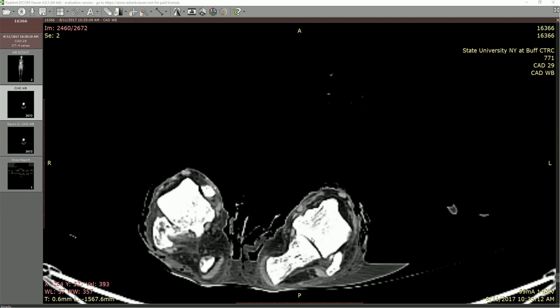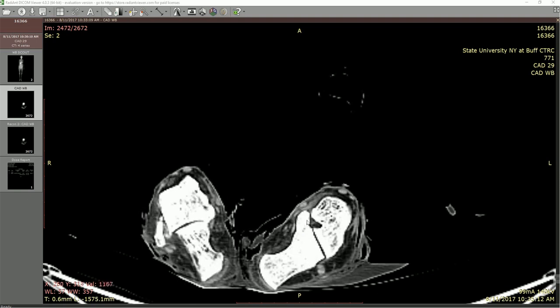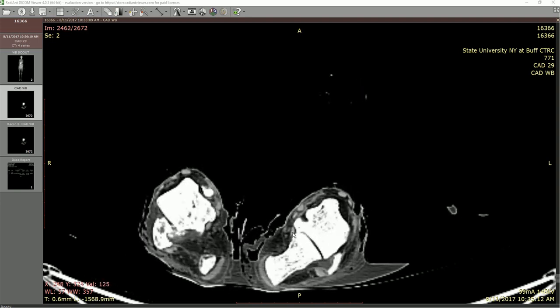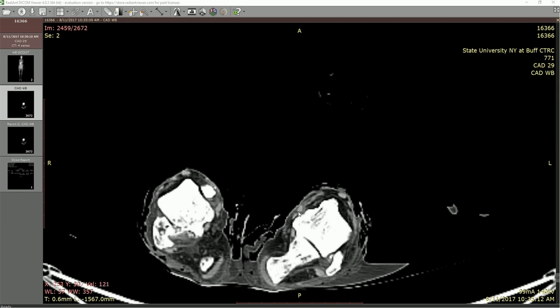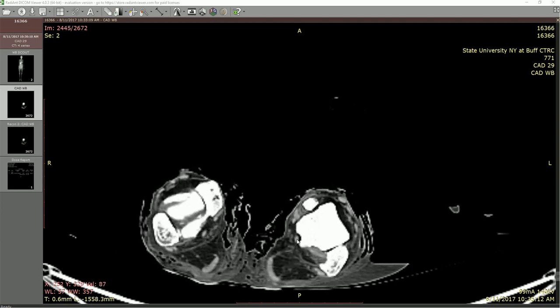We can see more of the body of the calcaneus articulating with the talus — that's the talocalcaneal joint. Something else of interest: this is the sustentaculum tali of the calcaneus — the calcaneal shelf. If we look just back here, we see this small little divot — that is the flexor hallucis longus tendon, which as we talked about goes right underneath the sustentaculum tali. Moving up, we can see flexor hallucis longus. And on the other sides, tibialis posterior and flexor digitorum longus. This gives us our 'Tom, Dick, artery, vein, nerve, Harry' — flexor hallucis longus on this side.